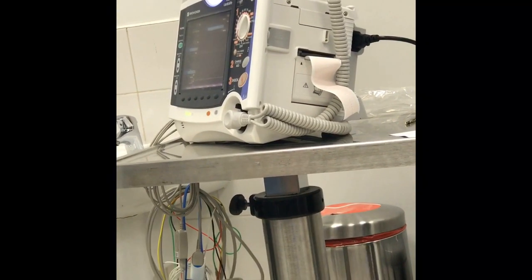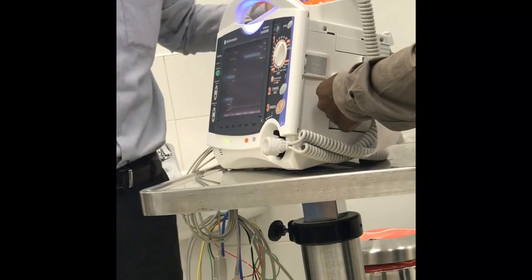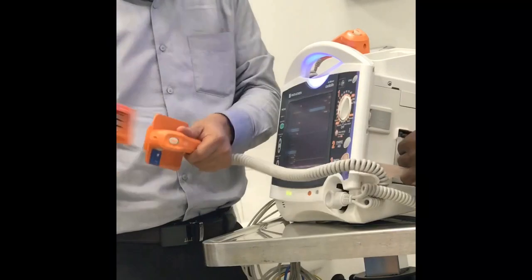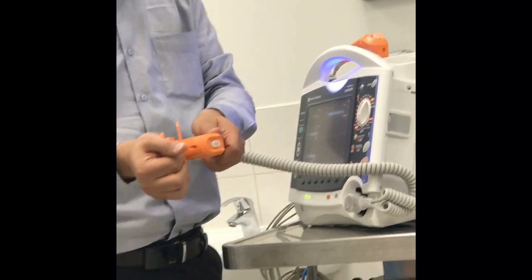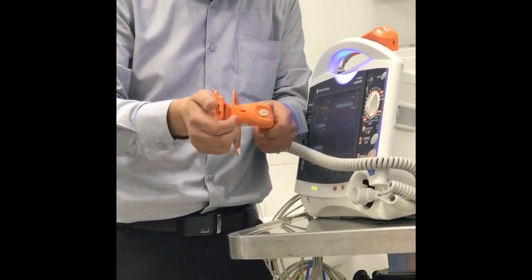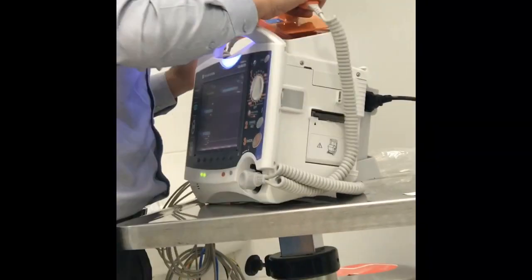So as hardware, as an accessory, is it clear? Plus you have the paddle here. The paddle is for sure adult and pediatric. Just press this one down, take it out, this is pediatric, adult. And as I know, nobody is using paddles, they are all using disposable pads, correct? Clear as a machine from outside. Any questions?